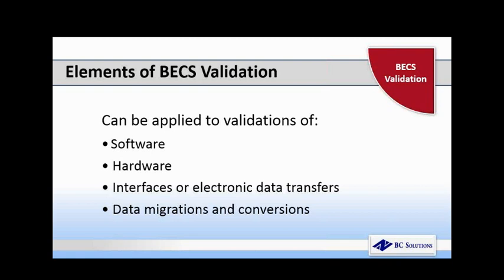And you can also use these elements to validate your data migrations and conversions when you're moving from one system to another. Next slide, please.